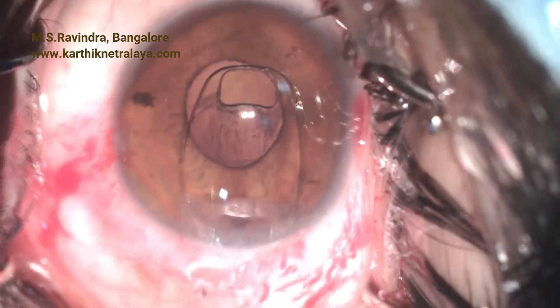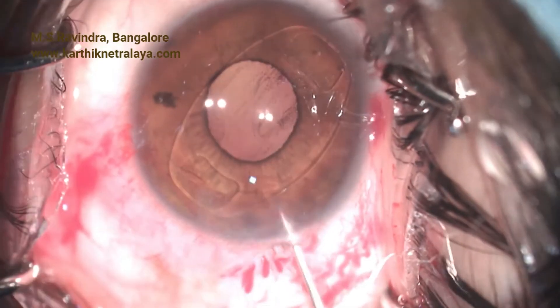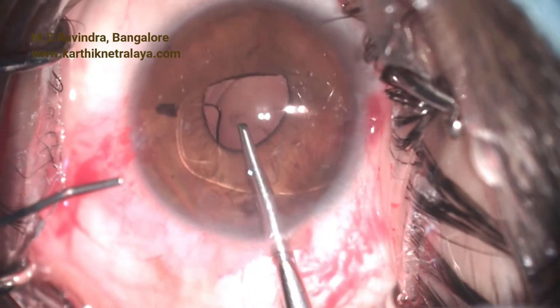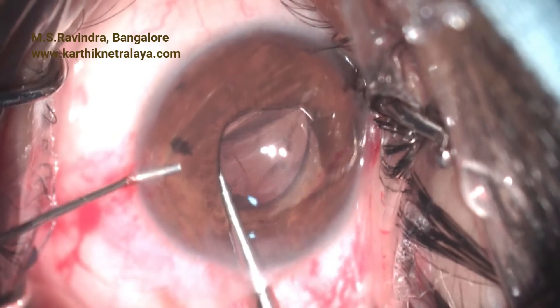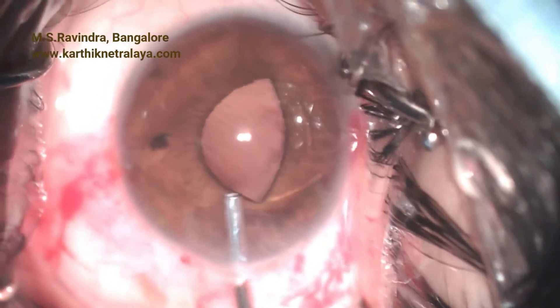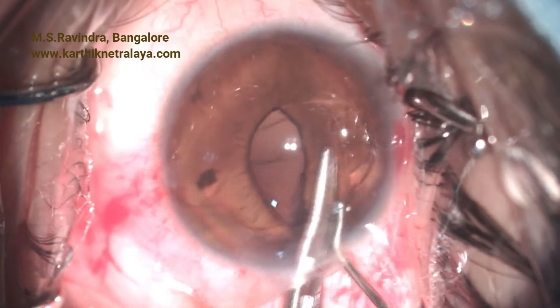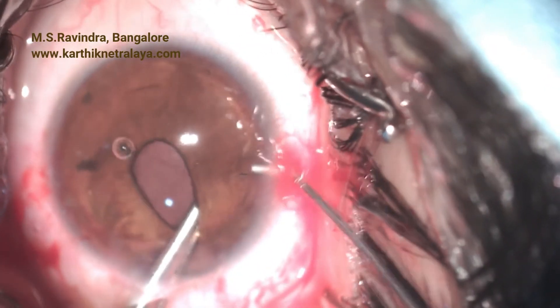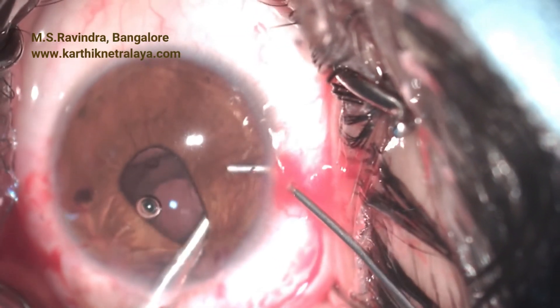0.2 ml of 0.5% pilocarpine is infused into the anterior chamber to constrict the pupil to about four millimeters. An iris claw lens is implanted and rotated in the line of the MVR entries made initially. The lens is held at the haptic-optic junction and taken behind the iris. Identifying the slit in the haptic, enclavation is done by lifting the haptics up using a short 27-gauge cannula to reform the anterior chamber. The same is repeated on the other side — a very simple, elegant, and quick technique. The posterior capsule is retained and could opacify over time, which can be treated with a YAG laser. Finding the haptic opening is important and can be done by lifting the haptics up and looking at the haptic-optic junction.